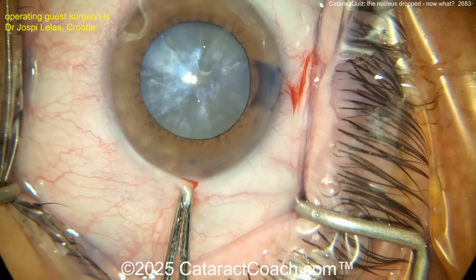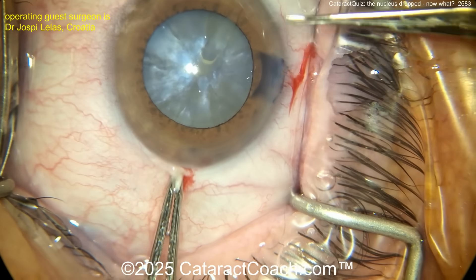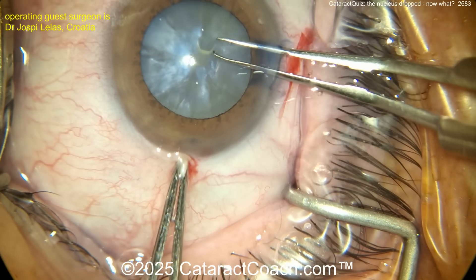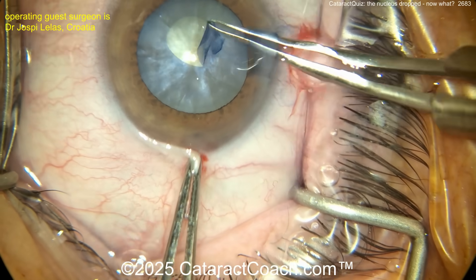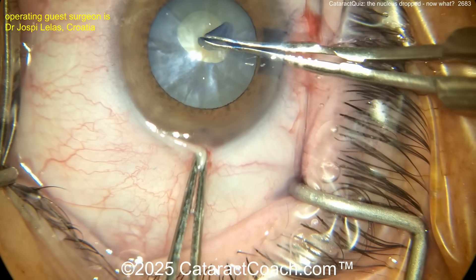So far so good. Now what do you want to do? Maybe the double rhexis technique — maybe start off by making a baby rhexis first, then further decompress. I like this idea — there you go — and now we'll decompress it.